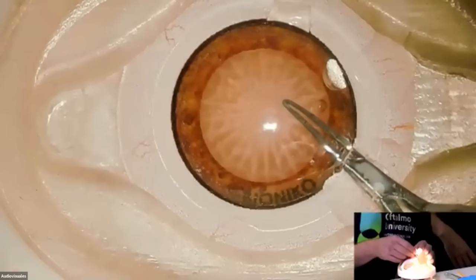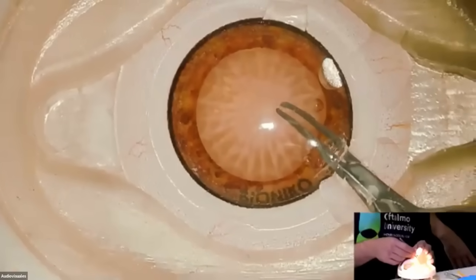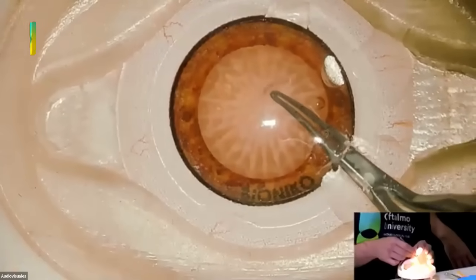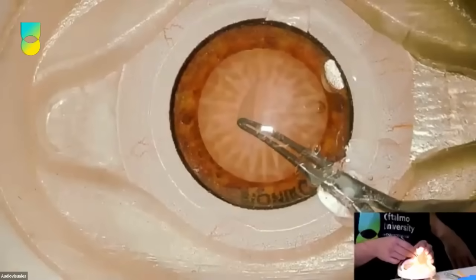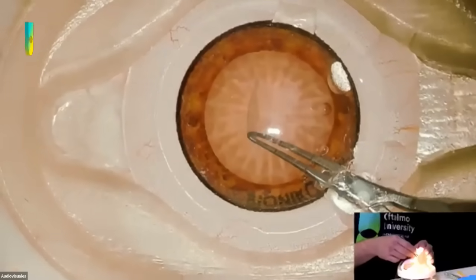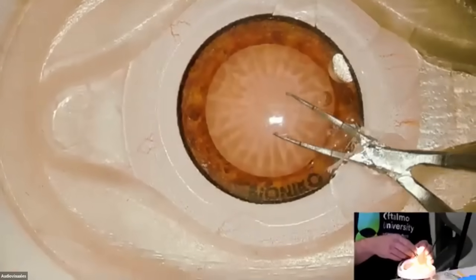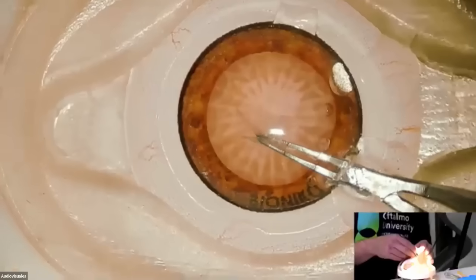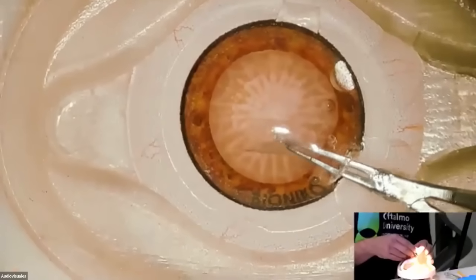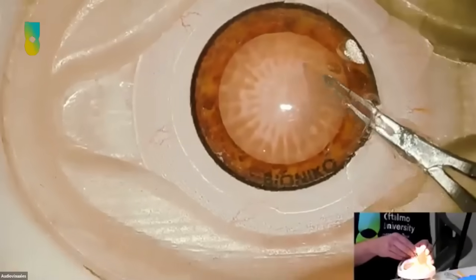You can't doubt for a second, because it happens very fast, especially with those white cataracts that you grasp, you just tear at the center and they go. So you have to rescue in just a moment. You have to practice this many times so that when you really need to rescue a Rhexis, you can do it right away.